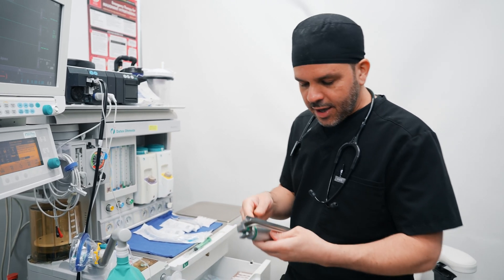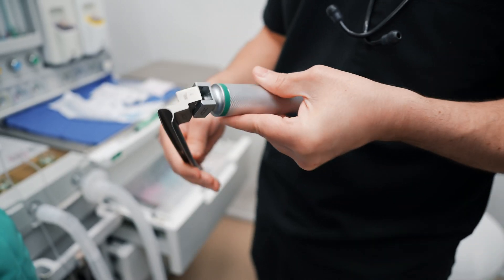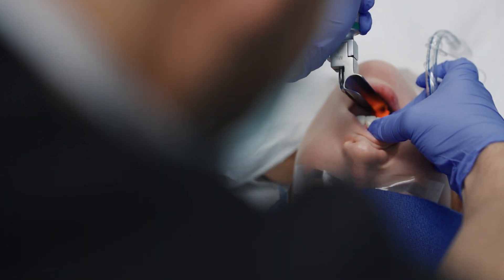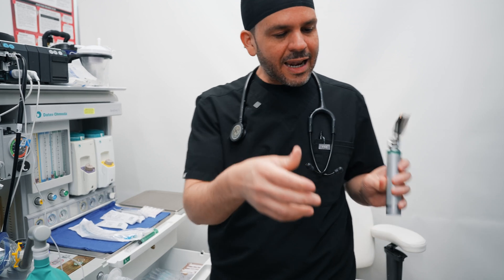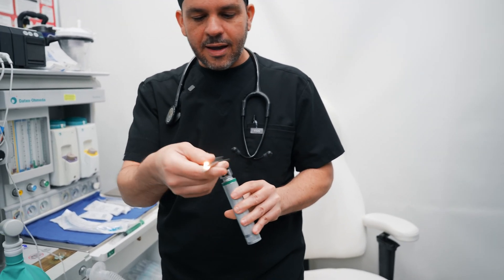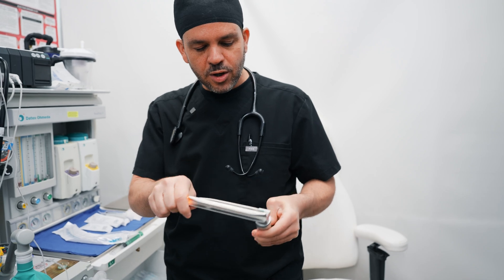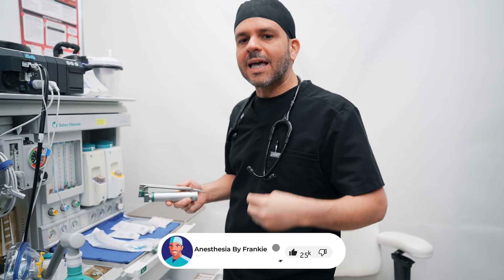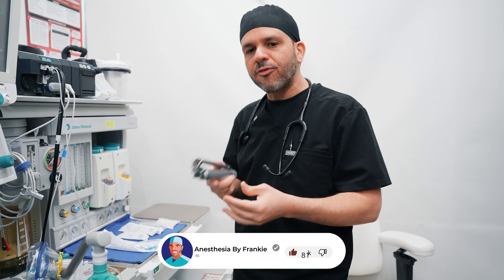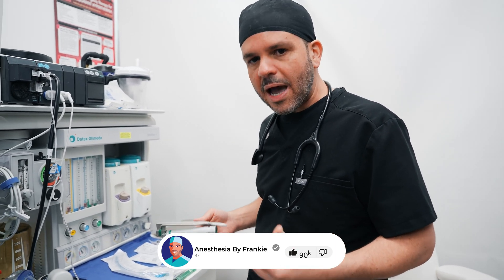The next thing I do is get my laryngoscope prepared. This is what's going to allow me to visualize your trachea in order to insert that endotracheal tube. I make sure the light is turning on and that the battery is strong enough to give me a view during intubation. This all happens after you're asleep, so you never feel the laryngoscope in your mouth or the endotracheal tube going in.